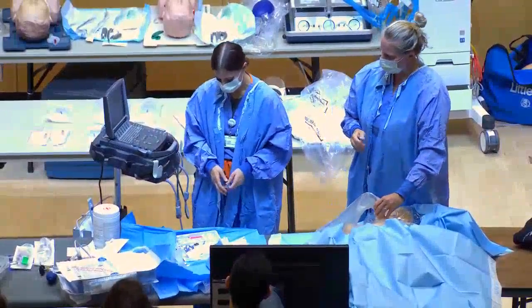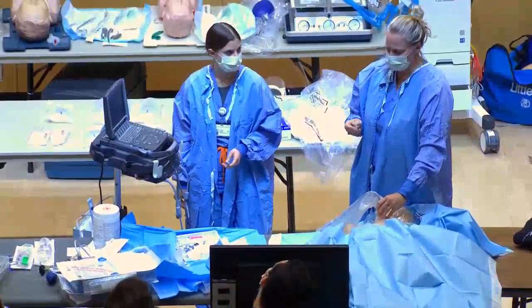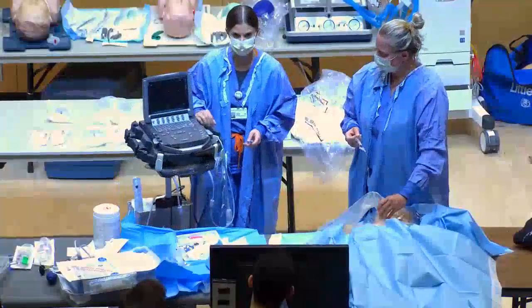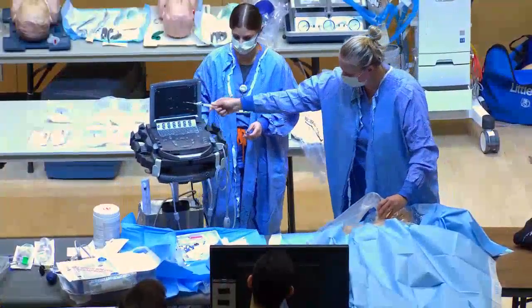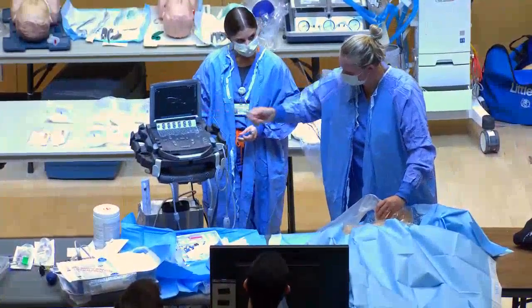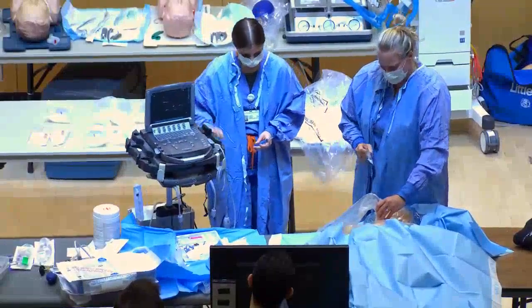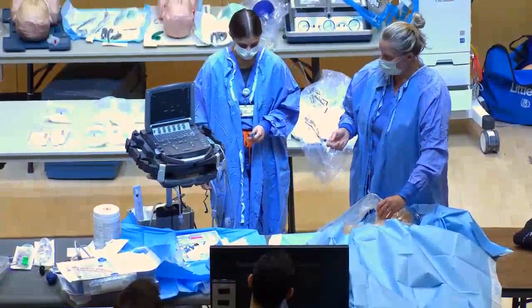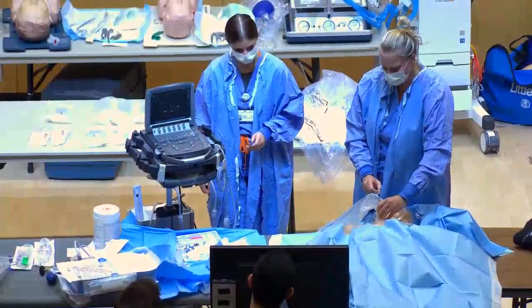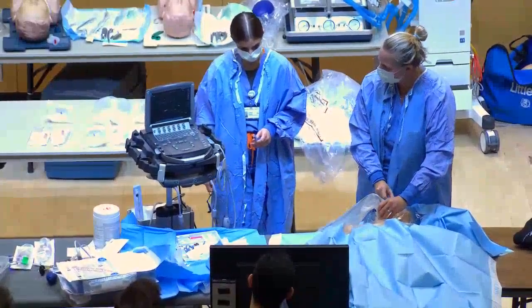On ultrasound you can see the vein because it collapses when you compress it — it goes flat. You can usually see the carotid pulsing underneath, which you obviously don't want to hit. On the mannequin it's not very clear, but you can see the IJ and compress it. I'll give a little lidocaine, make a skin wheal, then go in at a 45-degree angle — you can see where you are on the ultrasound as you advance.